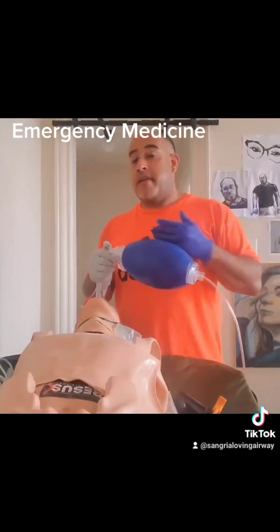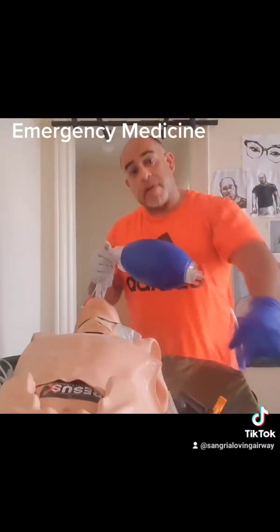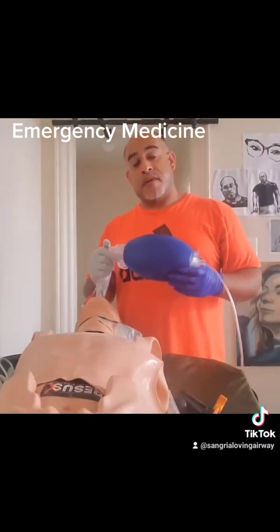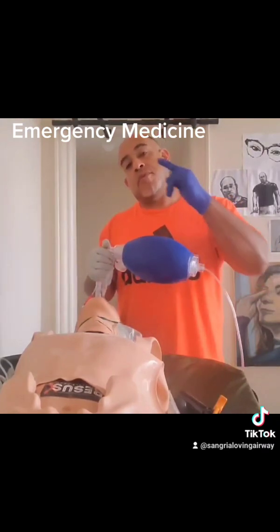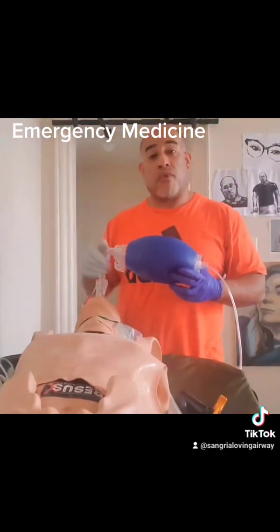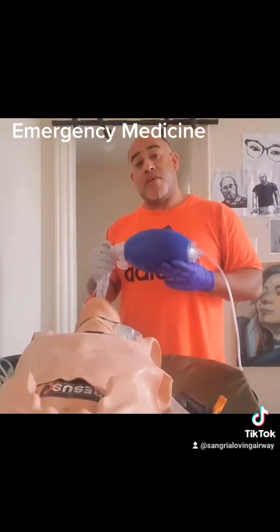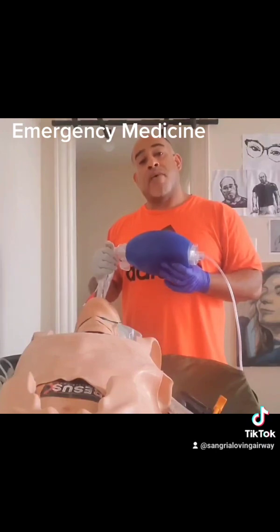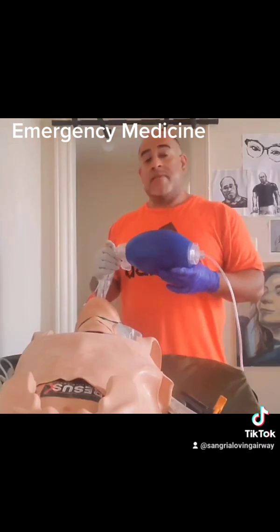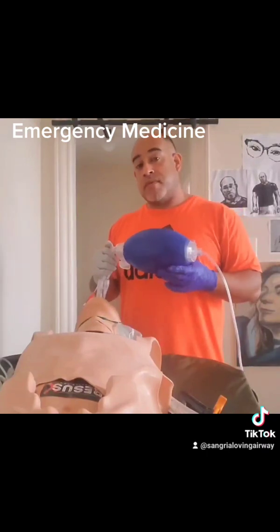If you're short-handed and you're the one running the code and you need to put an IO in or a central line in and give orders to give medications and control the airway, this is a convenient way of doing it. Now, if people tell you it doesn't work, you put the wrong size in or you inserted it too deep or too shallow. You didn't adjust to the waveform. You understand that? Adjust to the waveform to confirm it's in correctly, right? And bag correctly, right? Usually every 5 seconds. He just needs 12 breaths per minute, maybe every 6 seconds if you wanted to.